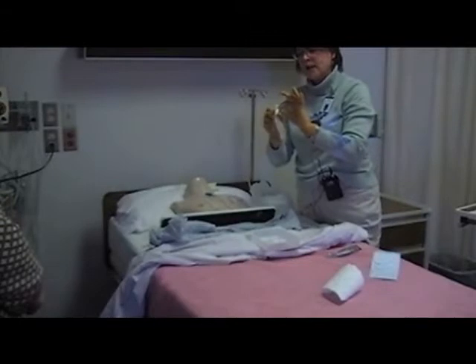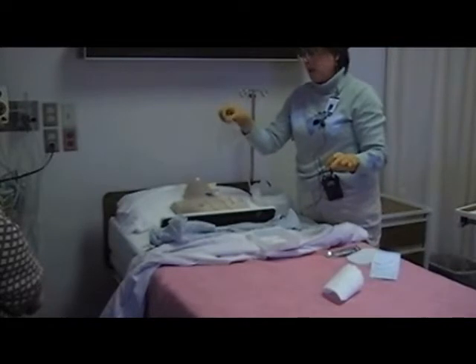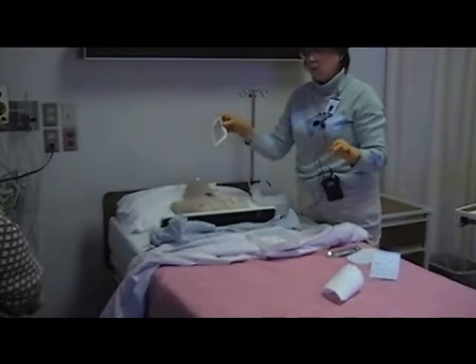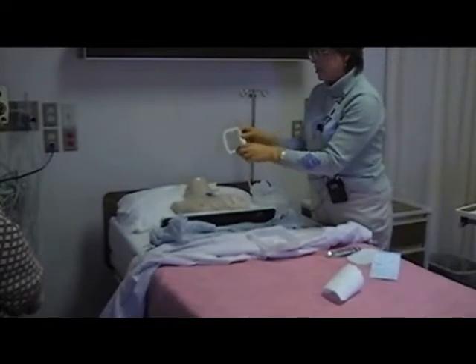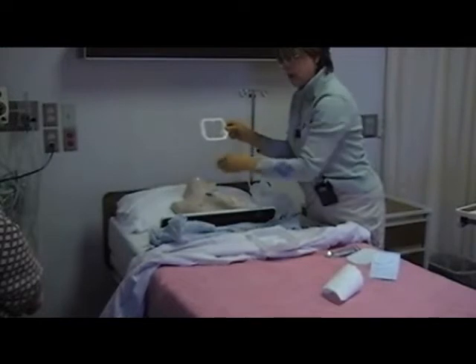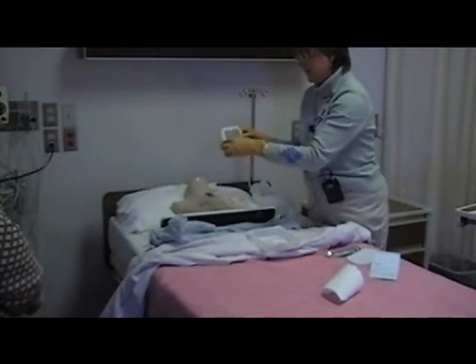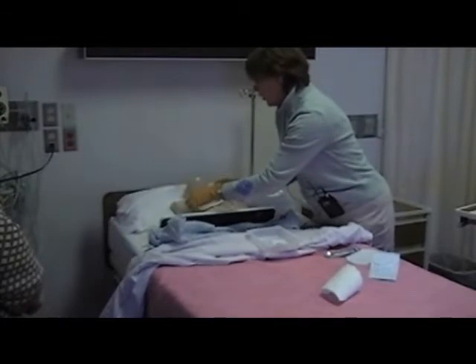I am not touching the part that has to stay sterile. I'm peeling off the entire thing. You'll notice it has a nice firm window around there so that it stays rigid. Okay. I don't want to cross my dirty hand over the sterile field. So I'm coming from below. I'm holding a corner that does not go on his skin.